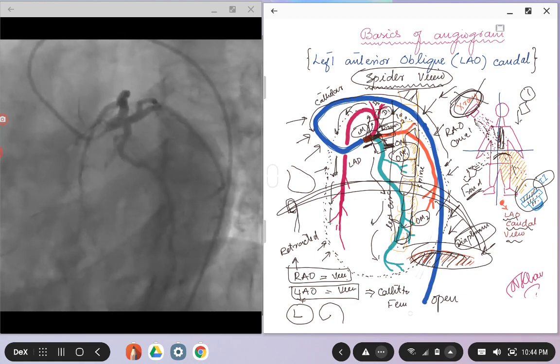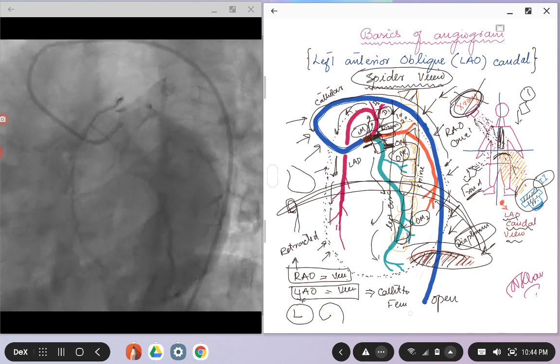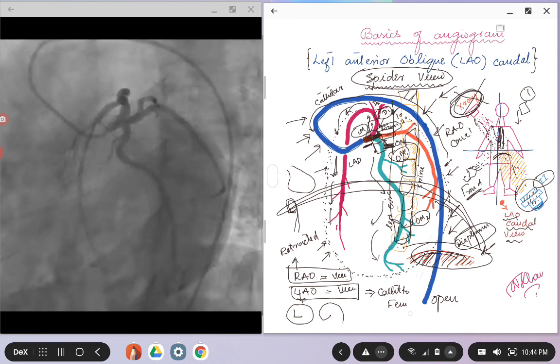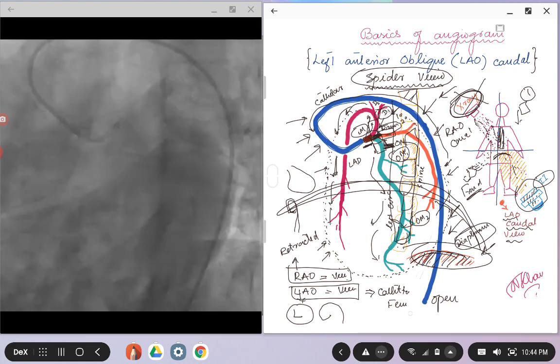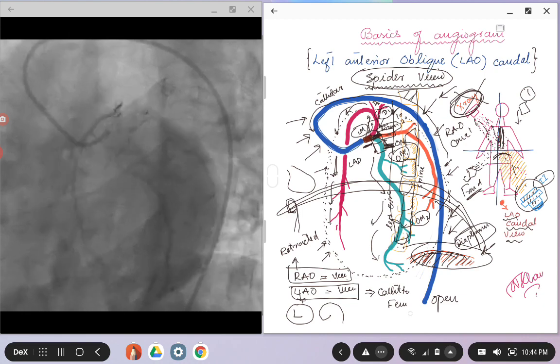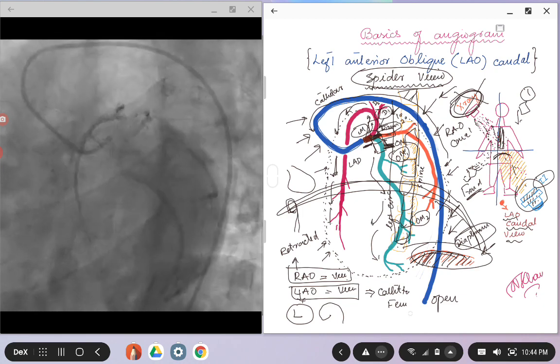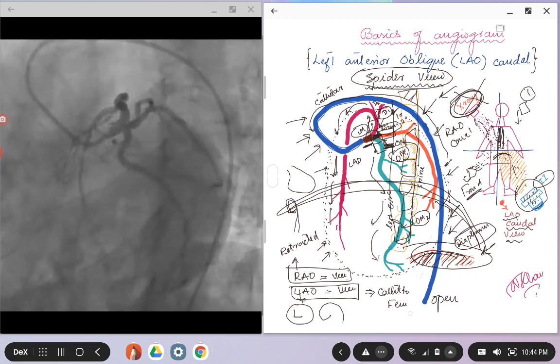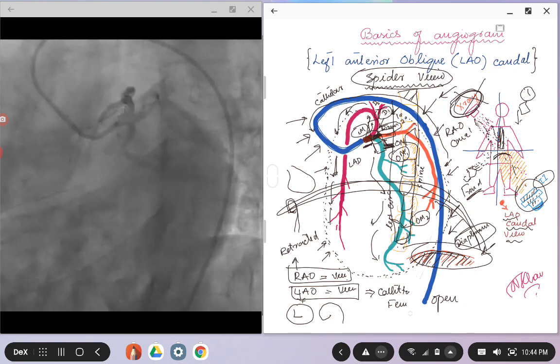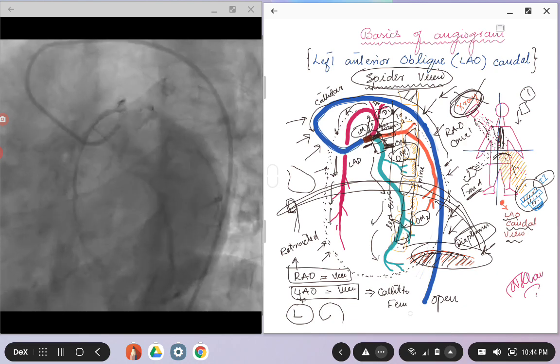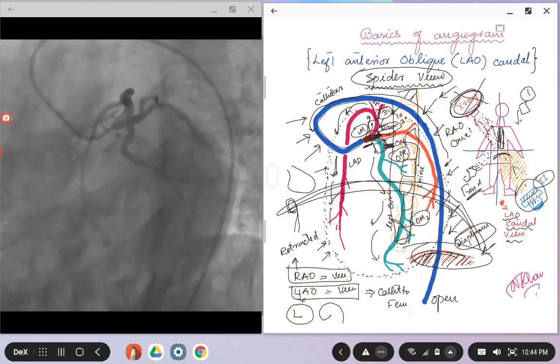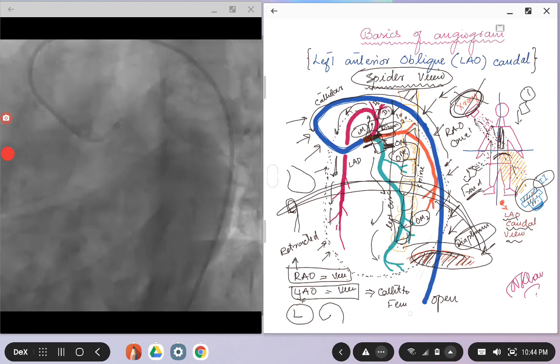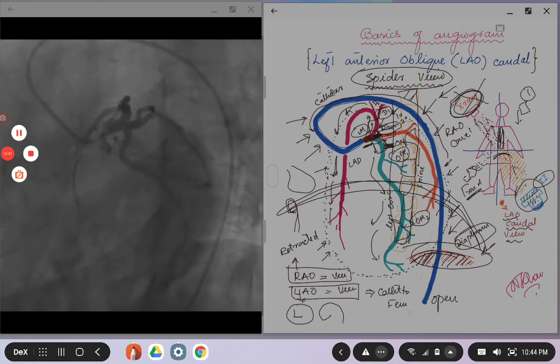I'll come up with the next view that will probably be the RAO caudal view, and once we will go over all the views, things will, I hope, start to make more sense. And the more and more angiographic films that you will see, that will make you more perfect. Let me know your feedback if you like these videos, especially the angiographic views, and anything you want to add to that. Have a very good day. Thank you.